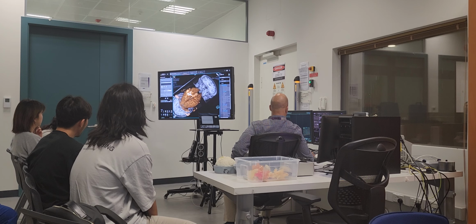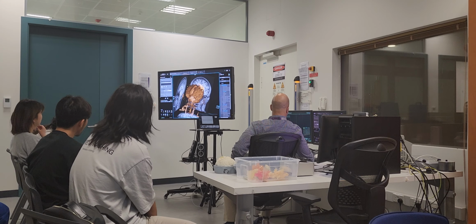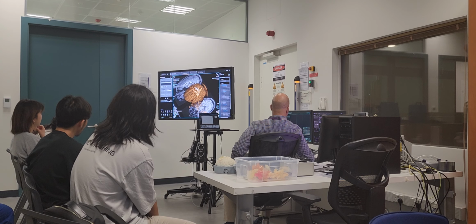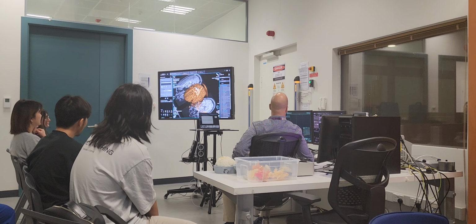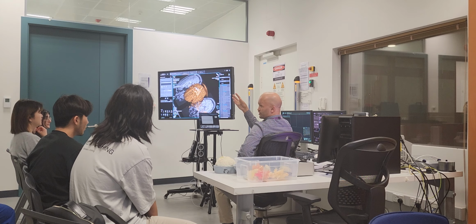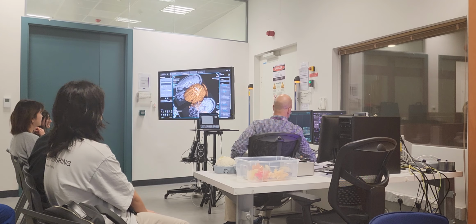See? So which side of the brain is this? Let's look at him facing us. So Asif now is facing us. So this is his right side, and this is his left side. And see here, this is actually his motor area and sensory area, because it looks like he was touching his fingers. So not only was he moving it, but he was touching it. So we have activation both in the sensory and the motor.